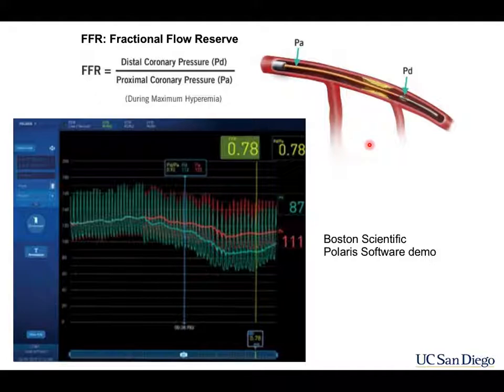So the question now is, for the clinician in the cath lab imaging a vessel, who sees that their contrast dye fills the vessel, and then they see it get narrow, and then it fills the vessel again, so they see the essential diameter reduction in that vessel: should we put a stent in there to open that vessel up?